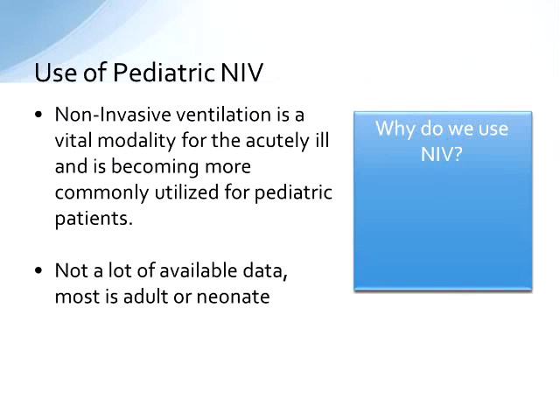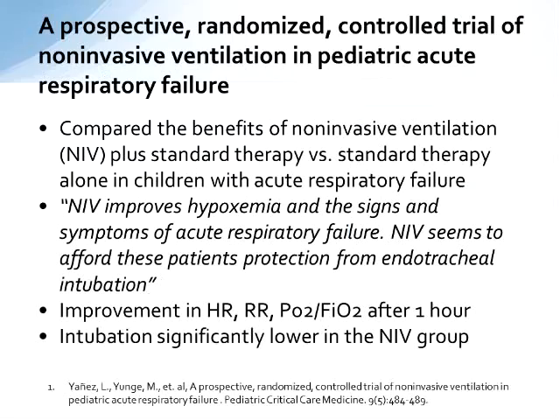So the question is, why do we use non-invasive ventilation? Why are we using it so much in the pediatric population, particularly when there's really very little data to support or refute its use in that population? So why are we doing that? And that study I showed you a few slides ago would indicate that most PICUs are at least using it in some form on their patients. And the truth is, the reason we use it is because it seems to work. Right? It seems to do all the things that we hope that it would do in the adult population. It seems to avoid invasive mechanical ventilation. So resourceful as we are as respiratory therapists, we give it a go, and it seems to be working for these patients.